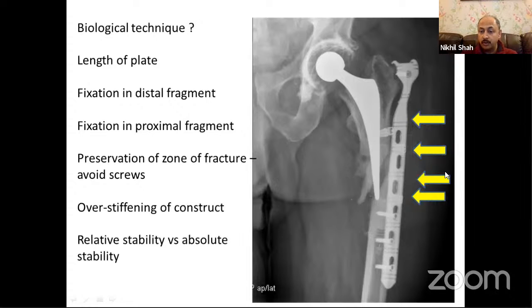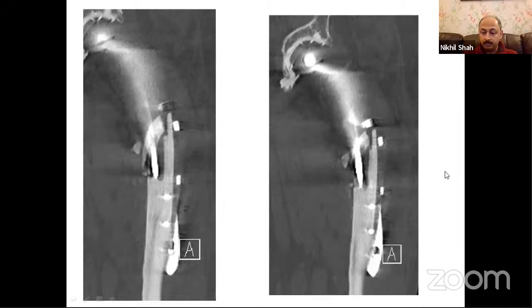And the central zone has been violated by the use of these radiolucent bands, something like a Parham band or a Partridge band or that sort of stuff. The construct is neither overstiff, but in fact it's quite unstable. And so that's going to fail. And he came during the COVID crisis.